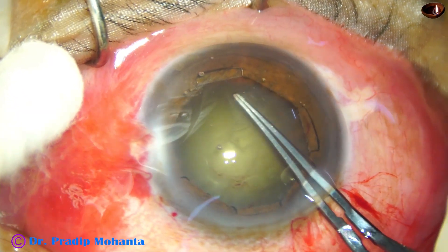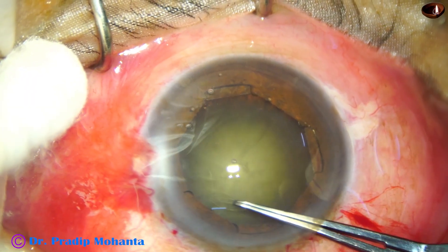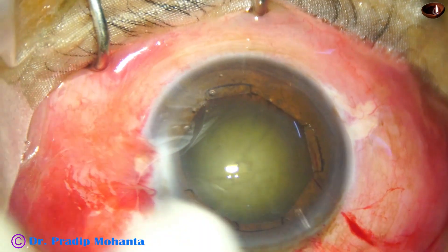So I need to do a large rhexis of about 5.5 mm, because the nucleus is also hard — and it is done.